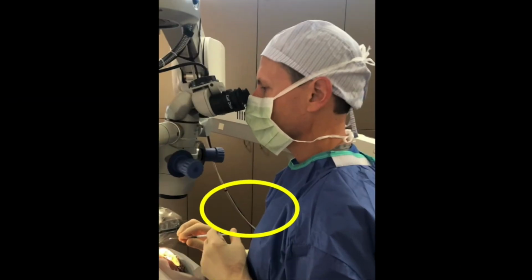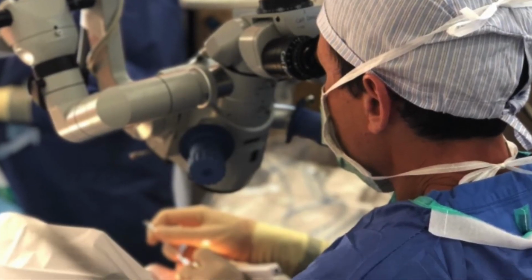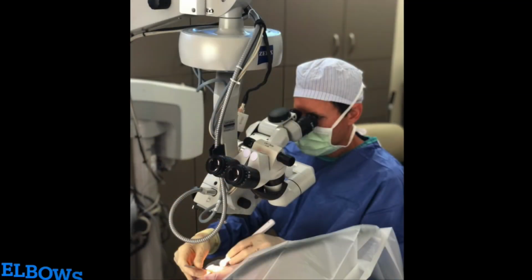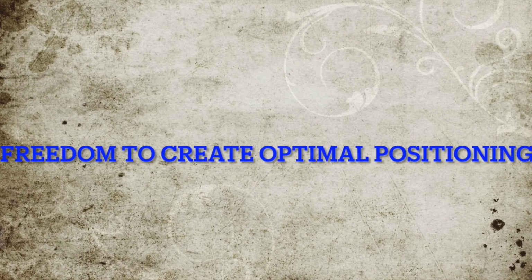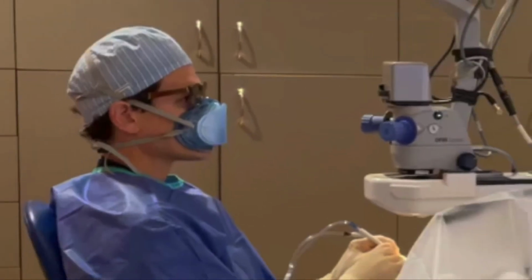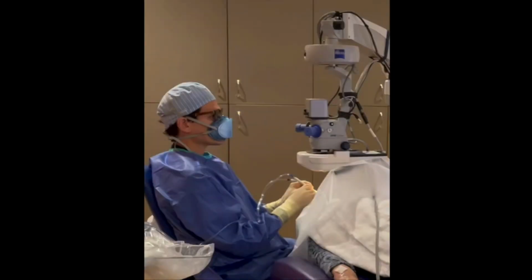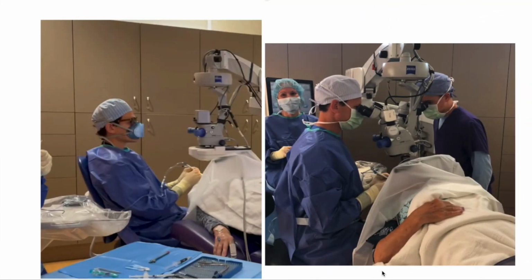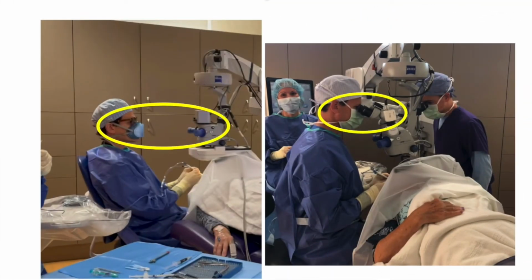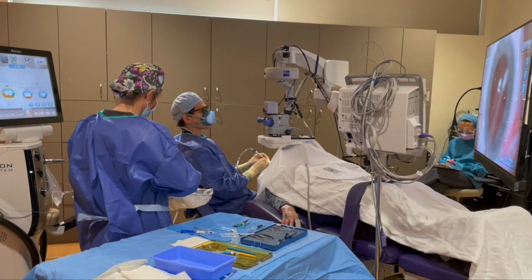This is utilization of the operating microscope. I have to keep my body at a certain position within inches of the oculars over the body. It limits my ability to use my elbows and wrists as I try to maneuver to certain areas in tougher cases or different size bodies or stretchers. Here with the Ngenuity system, I'm able to sit back and position myself anywhere from the head. You can see I'm now further away from any microscope, and I can recline back and be more comfortable.